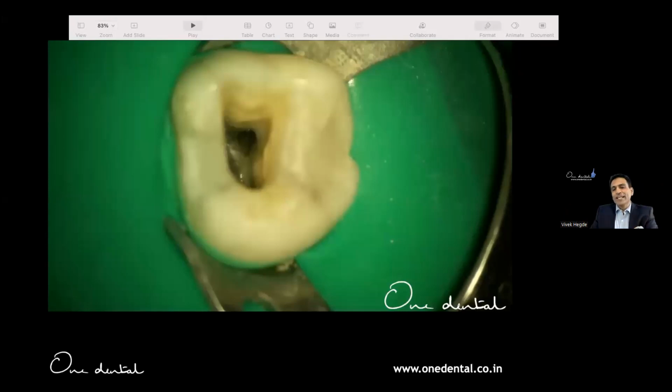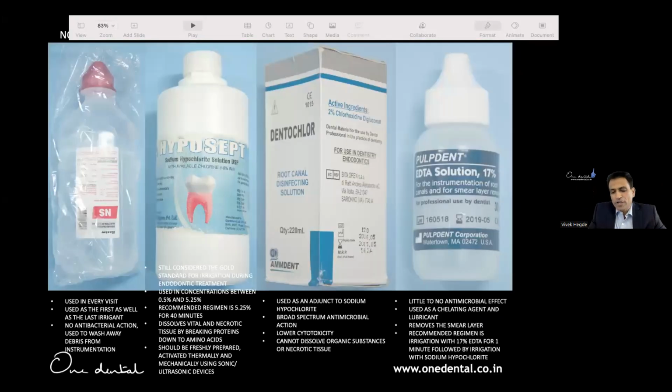That's when we use this technique of pre-curving files and going into the walls, hitting the deck, hitting between the GP point, hitting between the sealer and the dentine and trying to dislodge them and activating them. So that's important. So as I conclude, I want to stick to a few things here. I think I was given 45 minutes. I think we've done that, but give me 5 more minutes, please, and then we take questions.